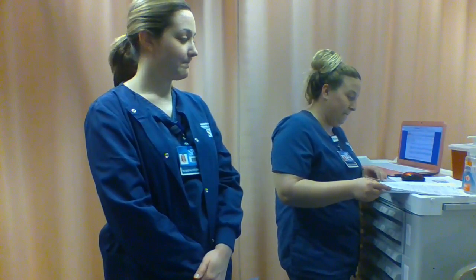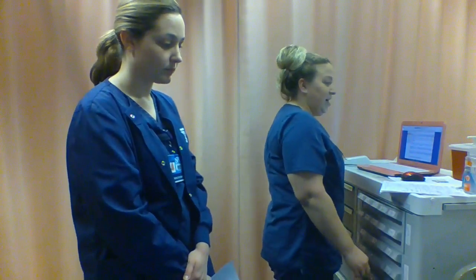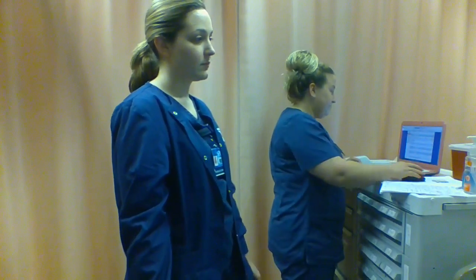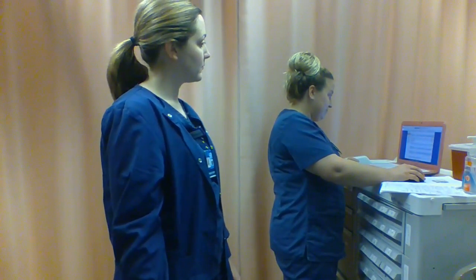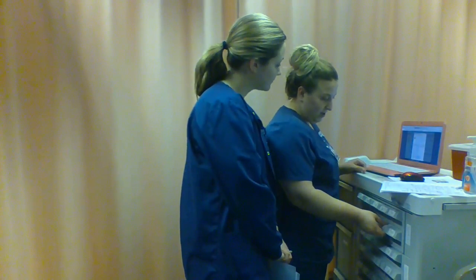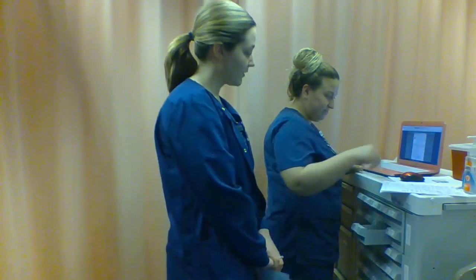You're welcome. All right, so do you have a preference where we give your insulin today? The nurse earlier gave it in my right arm. All right, so we'll go ahead and do your left arm. Okay, so I'm gonna get his insulin out of here.